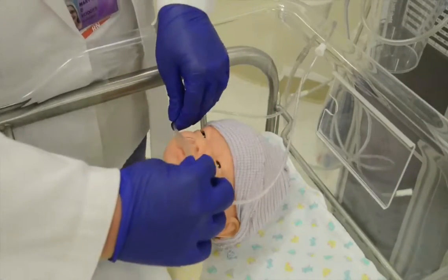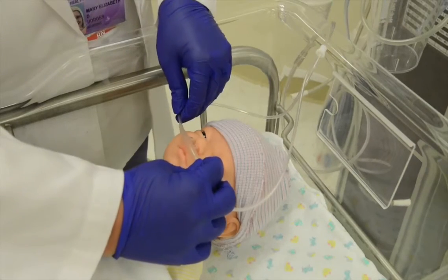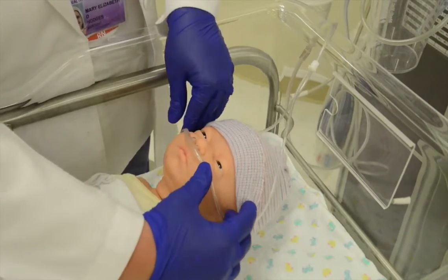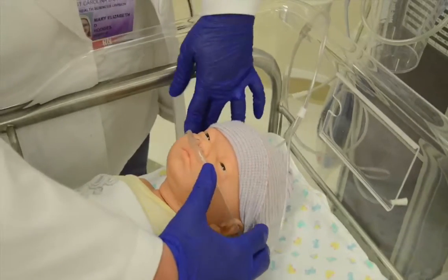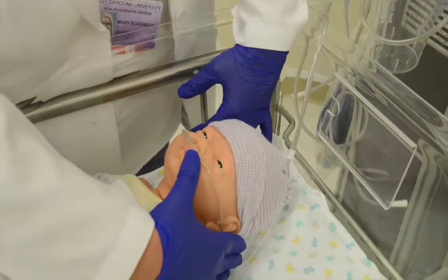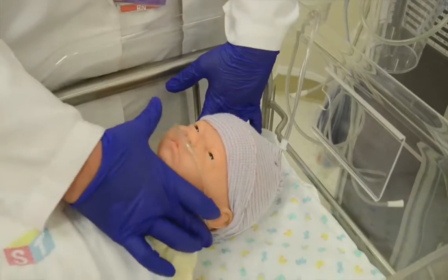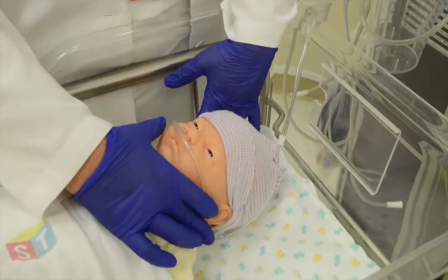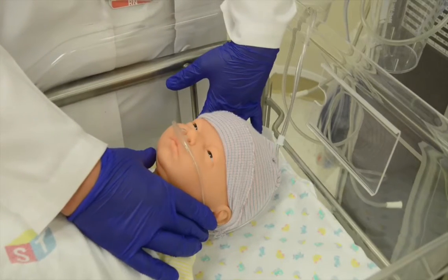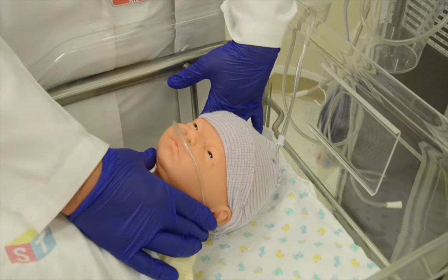Place the prongs into the infant or child's nares as shown. Secure behind the ears and tighten as appropriate. Secure the sides of the cannula with the hospital or facility approved device.